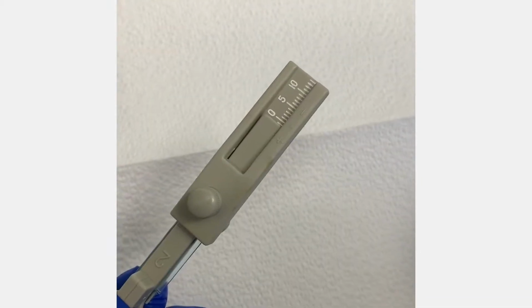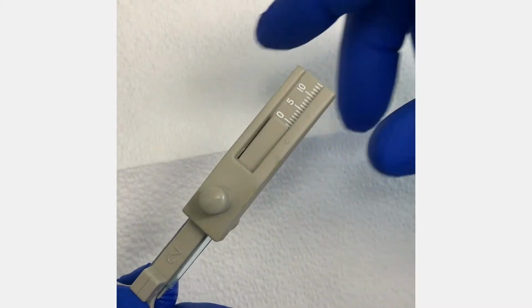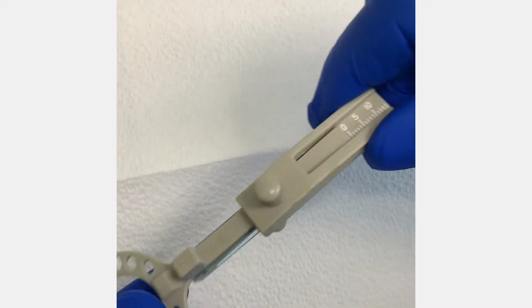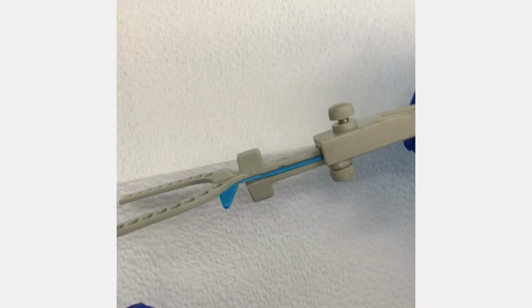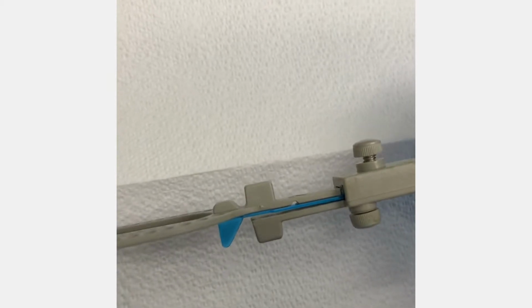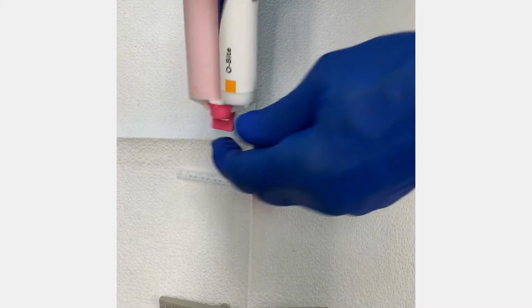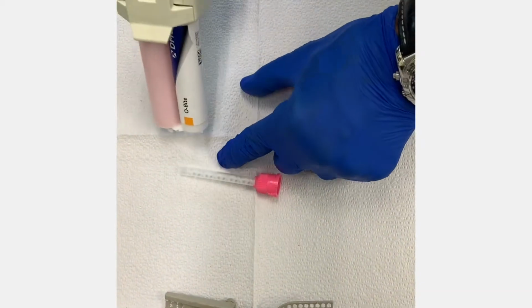A lot of dentists like to use measurements and go 50, 60, 70% of maximum protrusion, and that's where they want to mark the bite. I prefer to set the bite at a position I think is more comfortable for the patient, place that in their mouth, make sure that their muscles can tolerate that, and that's where I want to set the bite. Bite fork is set, we can take the bite registration.